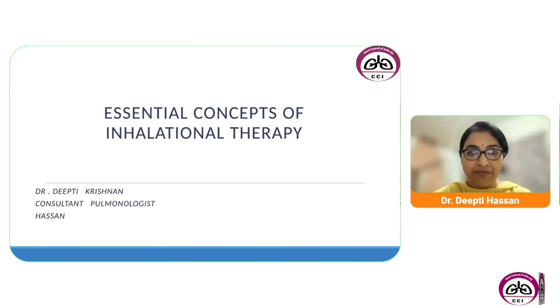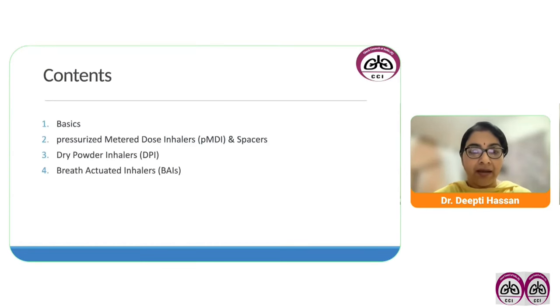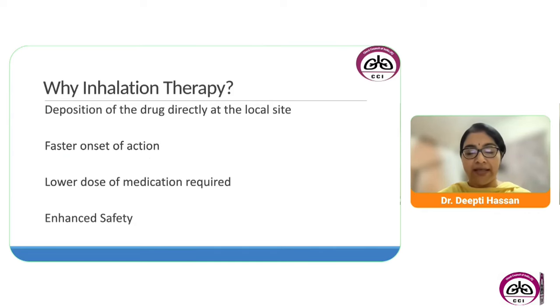So let me begin with the essential concepts of inhalational therapy. We'll be covering the basics with the meter dose inhalers, dry powder inhalers, and breath actuated inhalers. So why inhalational therapy? Because deposition of the drug directly at the local site causes faster onset of action, there is lower dose of medication required, and there is enhanced safety with very few side effects.